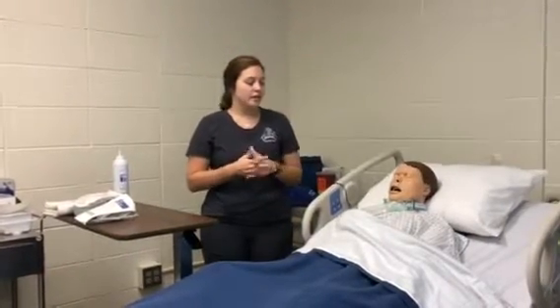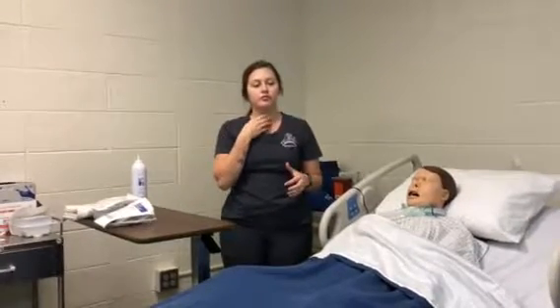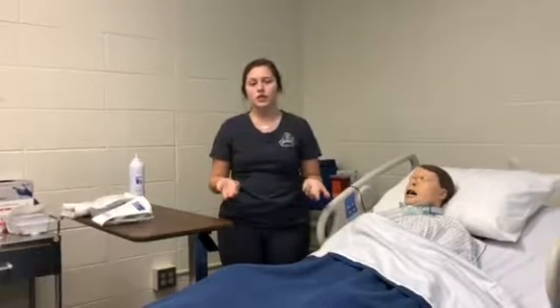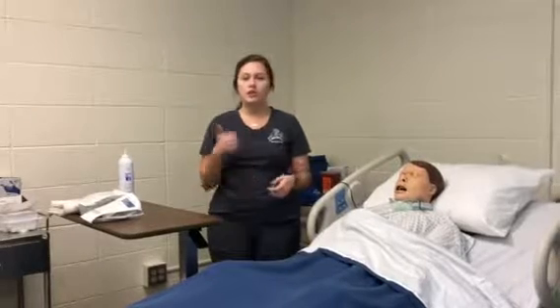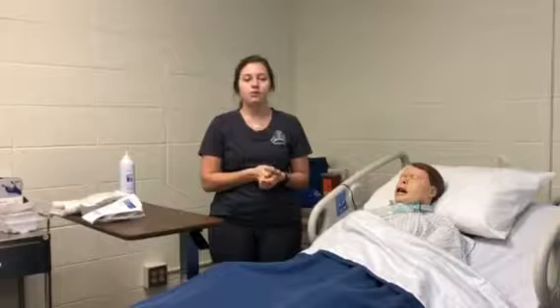And then you want to make sure that you explain to them what you're going to be doing. A lot of the times when you suction a trach, it's just a very invasive procedure. So a lot of the times they can't get good oxygen. So you want to give them a sign to use in case they need you to stop. Today we're going to be using a thumbs up. So if he needs me to stop, he'll give me that sign and we'll go from there.